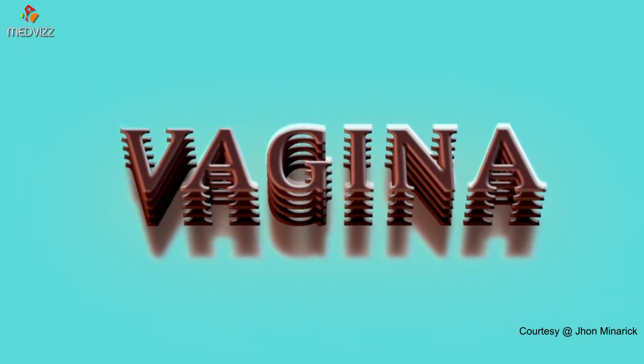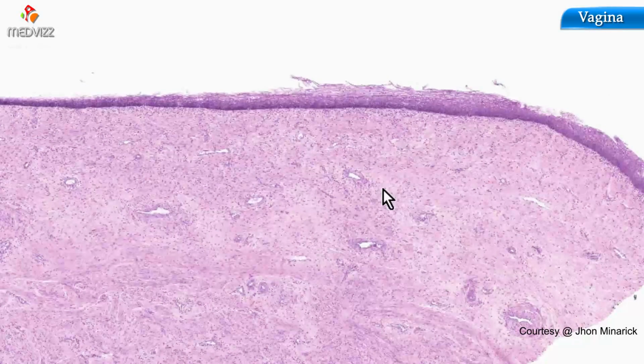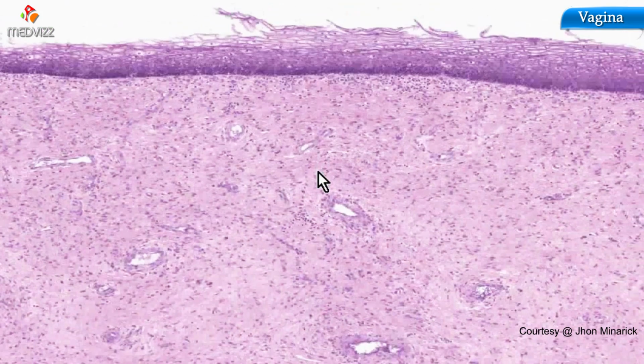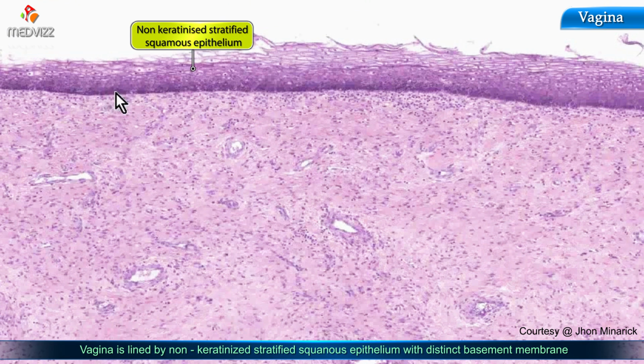classical appearance of the human vagina. Here is another piece of tissue which looks a lot like just about everything else we've seen. Rather boring, rather non-diagnostic of anything. But you can see it's a stratified squamous mucosa. It's not keratinized. There are no hair follicles.